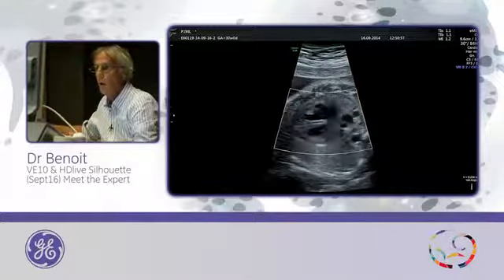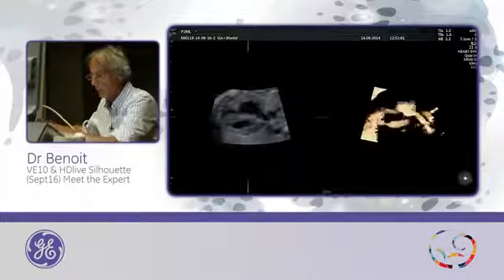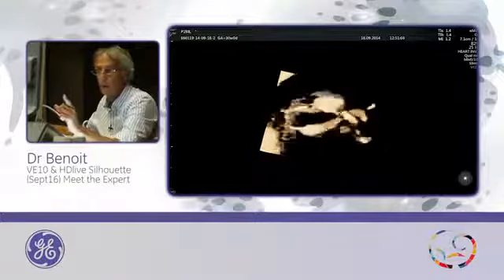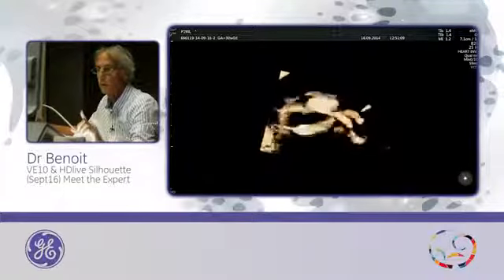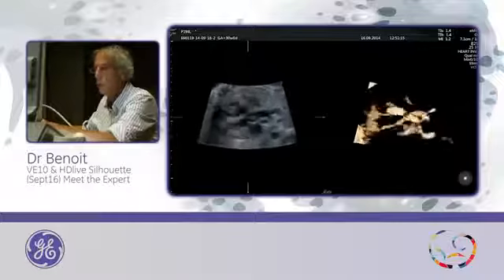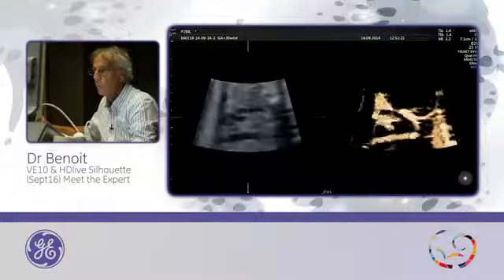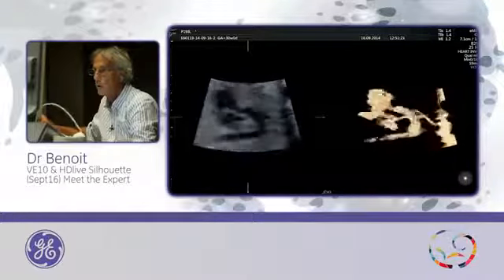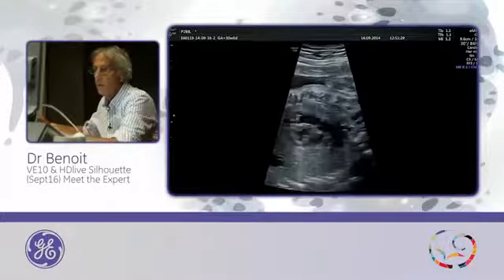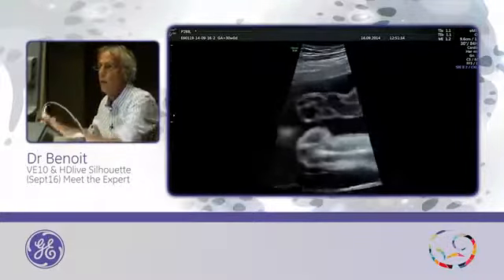So I will use 4D, and I will use a special setting. The name is VCA A-plane with inversion. I start. And this is the result. And now you have the picture with the crossing of the great arteries. It's quite easy to obtain. I will put the two windows together. And if you turn, you can follow the aortic arch like this.